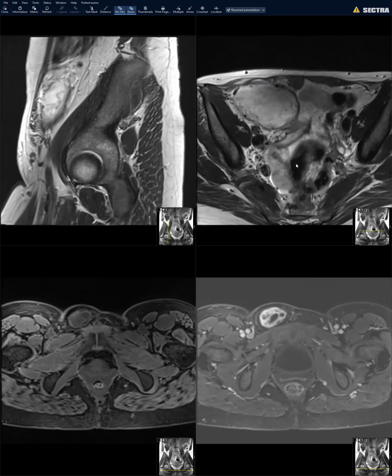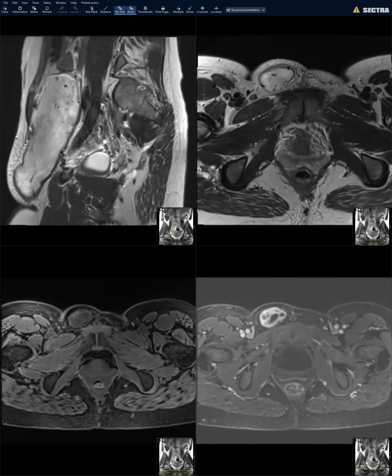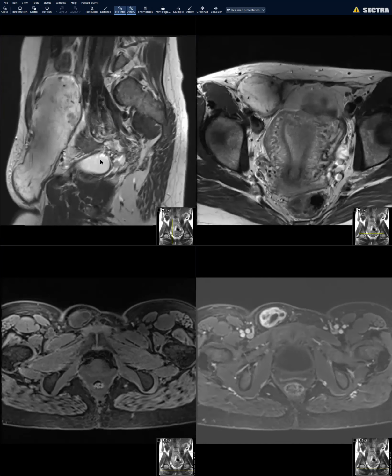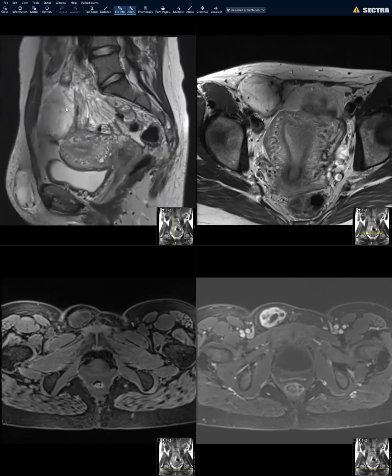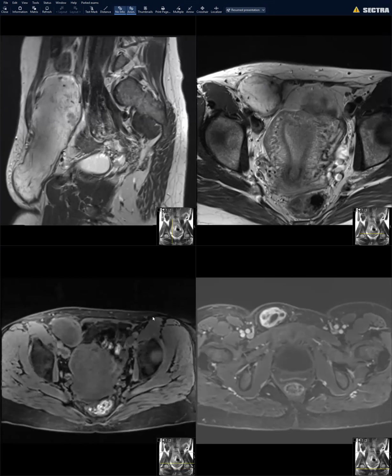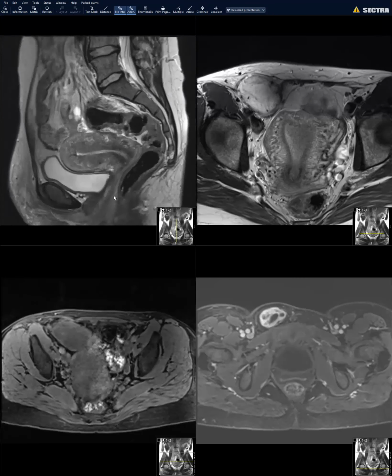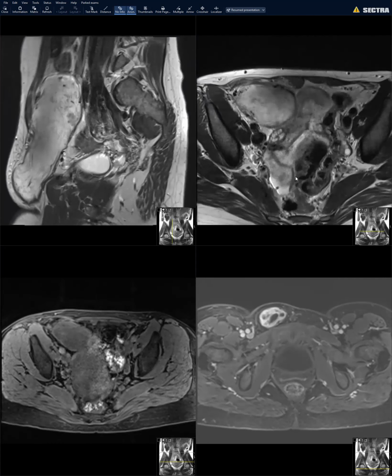So pathology wise, they actually called this one a solitary fibrous tumor versus an angiofibroma. It's one of those things where we tend to see some low T2 signal areas, but when we think of SFTs, we're not that used to thinking of lesions with flow voids like this. But it turns out that these SFTs in the pelvis can actually have low T2 signal either from collagen, fibrous tissue, or flow voids, which are actual vessels. So that's why they can hyperenhance, look fleshy.